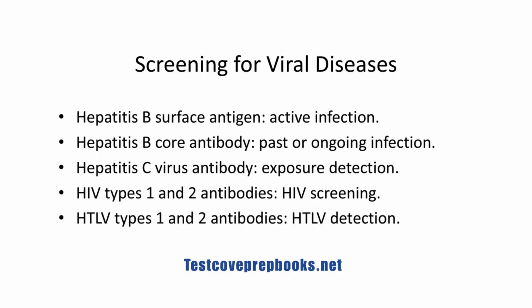Human immunodeficiency virus types 1 and 2 antibodies, which screen for HIV. Human T-lymphotropic virus types 1 and 2 antibodies, which detect HTLV infections.